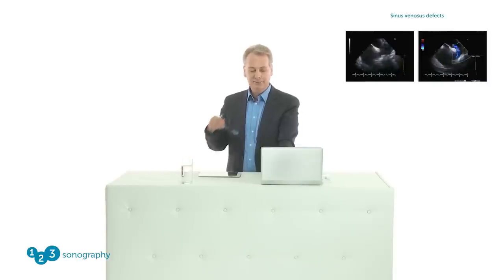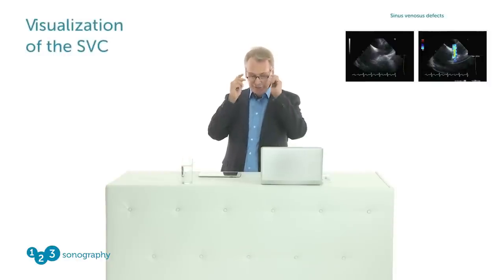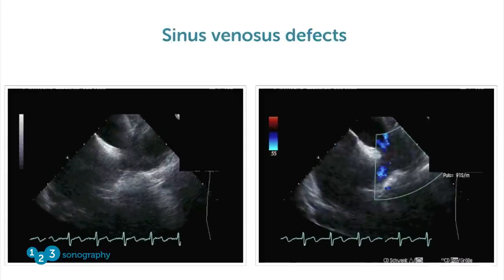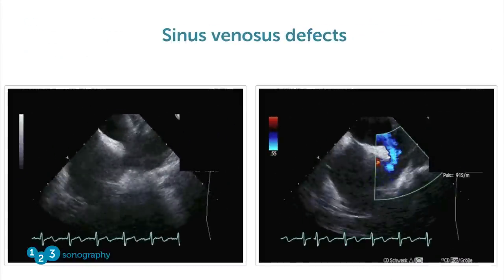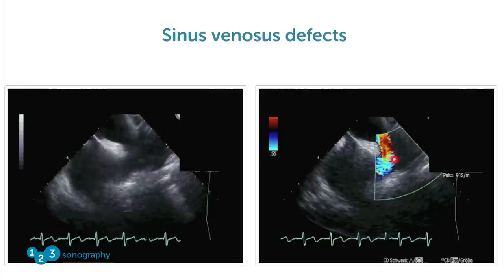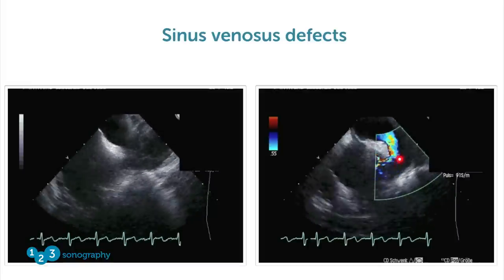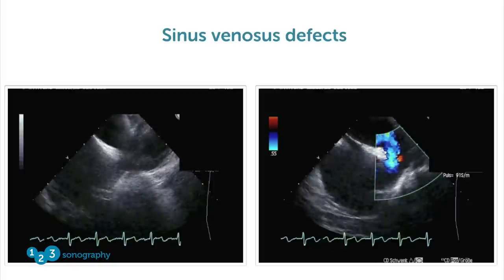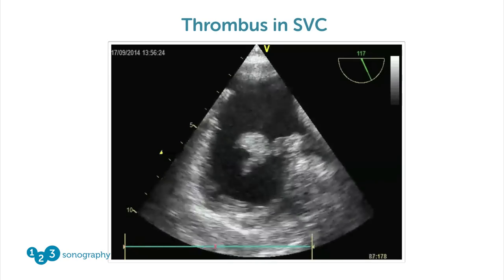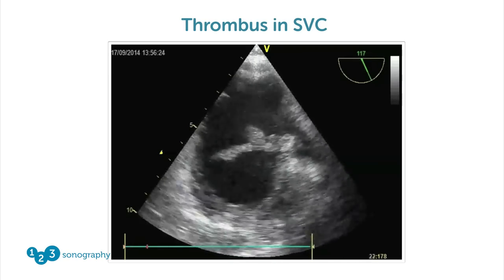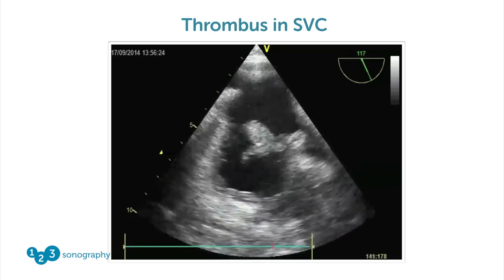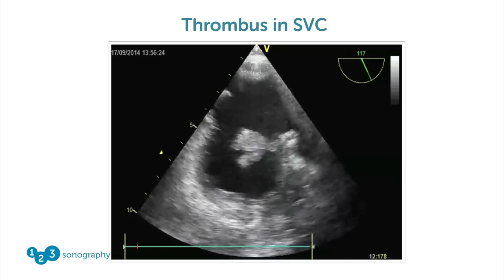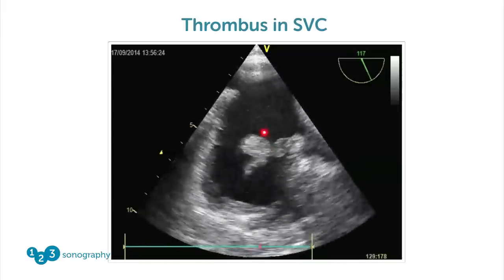TEE also allows us to look at portions of the superior vena cava which are very difficult to visualize from a transthoracic approach, and thereby allows us to see a so-called sinus venosus defect — the shunt is right where the superior vena cava enters the right atrium. Sometimes we have surprising findings, as in this patient who has a central line with a thrombus attached, protruding into the right atrium.